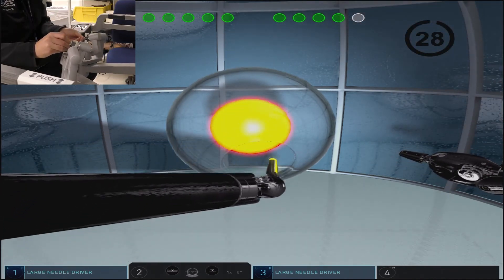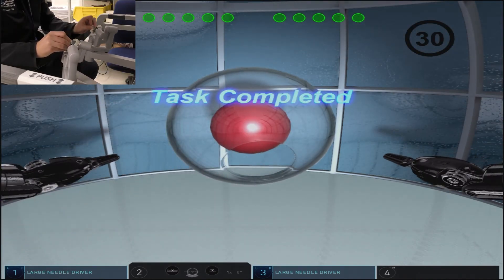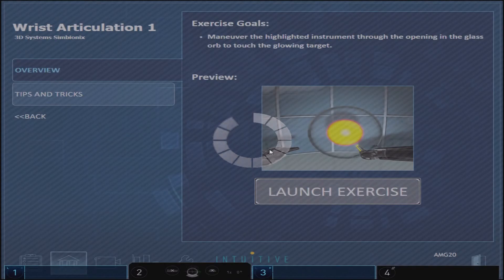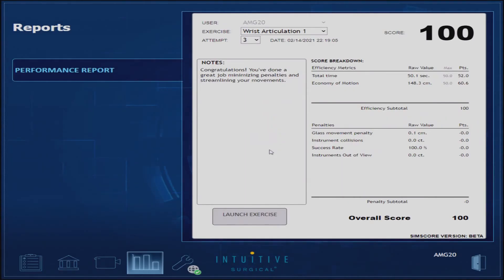By avoiding touching the edges or applying pressure directly to the glass globe, you can complete this task without incurring any penalties.